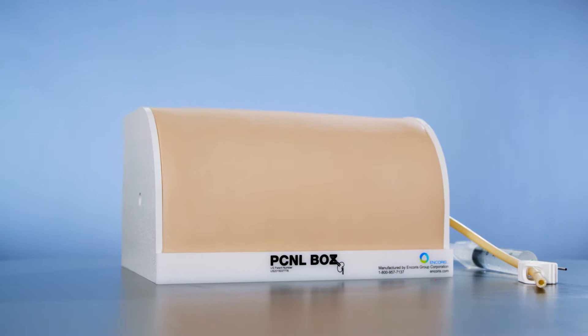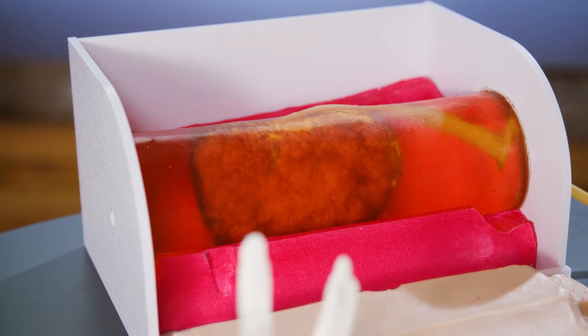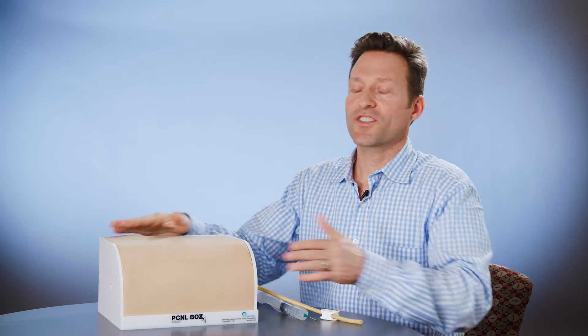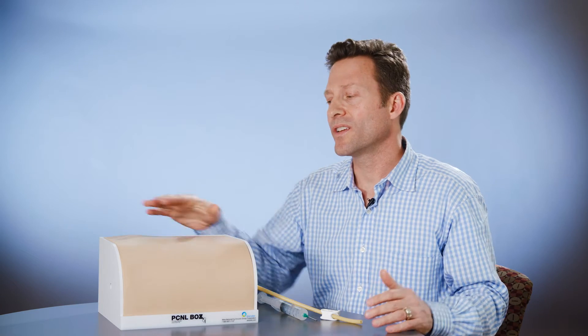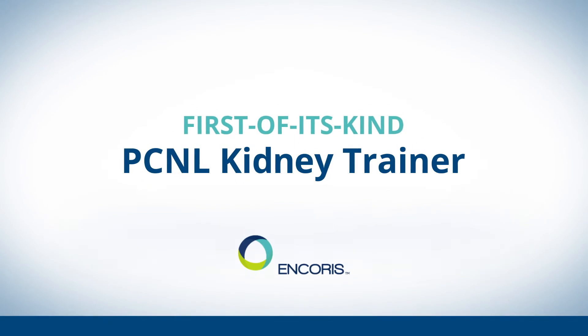Hi, my name is Jim Tenbrink and I'm the co-owner of Encorus. We're excited to share our newest surgical trainer, specifically for PCNL kidney training. What's very exciting about this surgical trainer is its lifelikeness, and it's also highly mobile. There's so much you can do with this compared to conventional means of surgical training, and really why it was invented was because of the lack of adequate surgical training for PCNL.